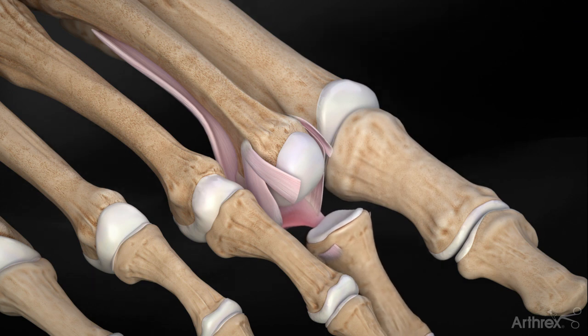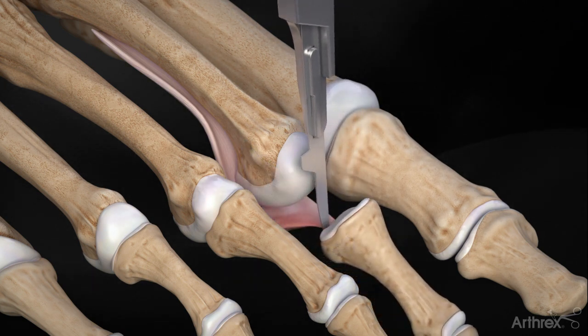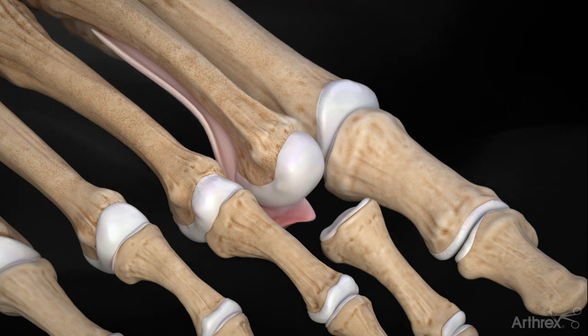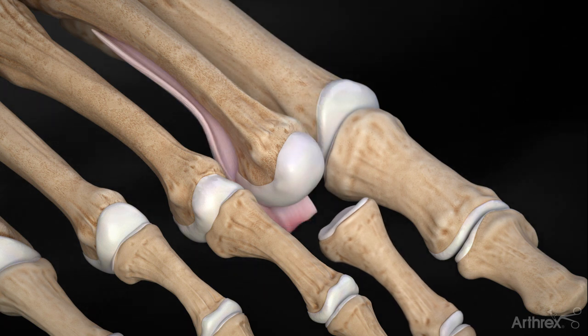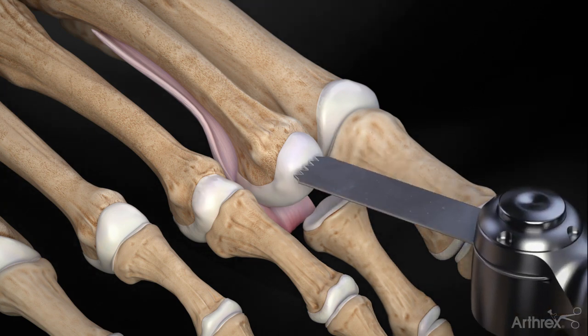The surgeon may choose to complete the tear of the plantar plate by excising any attachments at the base of the proximal phalanx. Next, an osteotomy is done of the metatarsal to shorten it while also allowing for better access to the plantar plate.